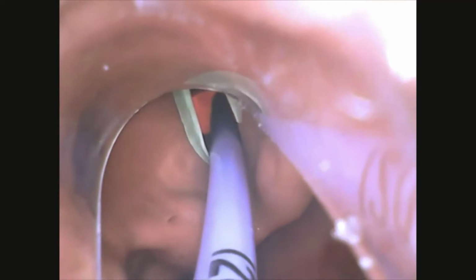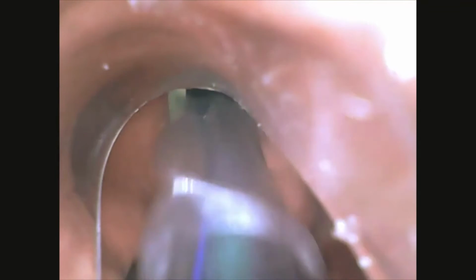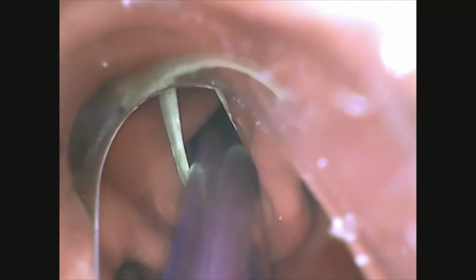Now the inside look. Put a little endoscope inside the V-scope. Instead of going midline, we're going to go corner of the mouth, bypassing the molars, visualizing those vocal cords, passing the bougie. We're going to remove the scope and slide the endotracheal tube. We are going to watch the endotracheal tube pass with the endoscope that we have here. And that's it, the paraglossal technique.